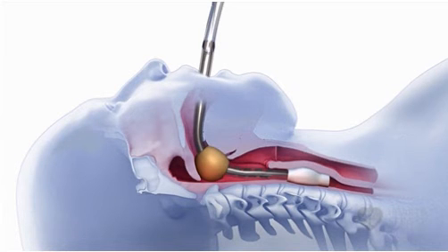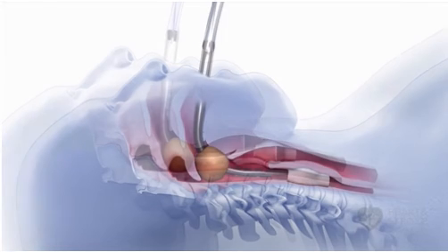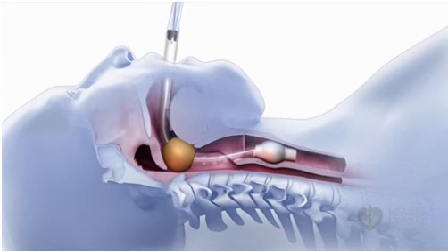The distal tip of the device will rest in either the esophagus or the trachea. If the tube rests in the esophagus, which happens most frequently, the cuff blocks airflow in and out of the esophagus, and ventilation occurs via lumen number 1 and through the small side openings into the trachea. If the tip of the tube comes to rest in the trachea, however, the rescuer can use lumen number 2 to deliver ventilation directly into the trachea.